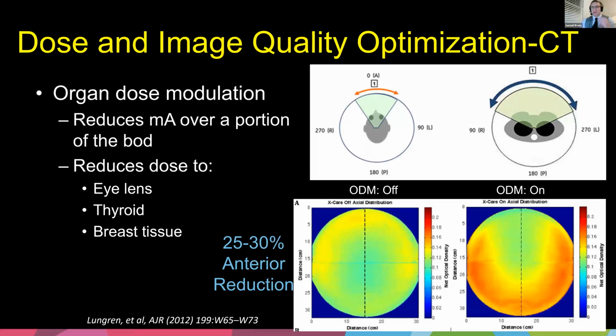You can look at that as two things. I actually didn't go into detail on this: there are prospective alerts and retrospective alerts. All CT scanners have the ability to have an alert built into them. You put the patient on the table and punch in all your parameters. When you click confirm, the scanner will calculate and say, oh, this MA and this KV are actually above what we expect. So there's an alert level built into the CT scanner.